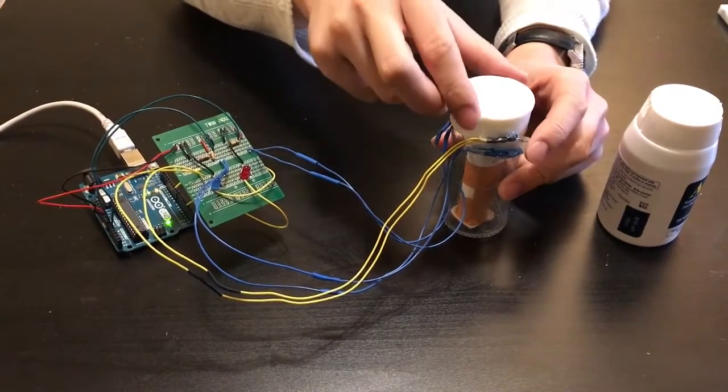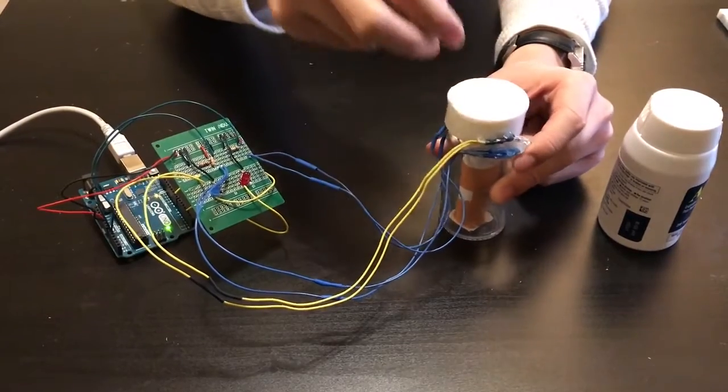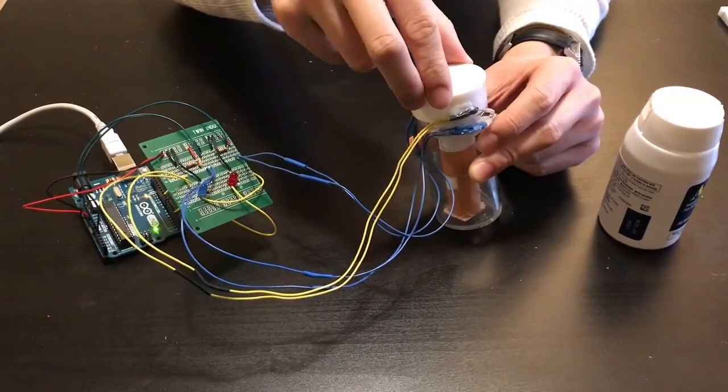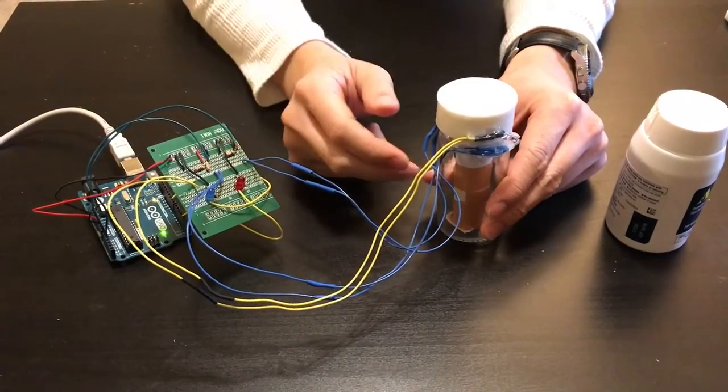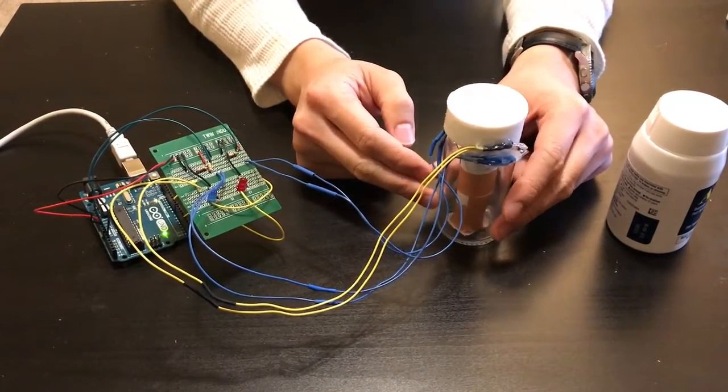To keep track if the patient has taken the pill we have an IR sensor to detect if the pill bottle has been opened and also a pressure sensitive resistor to count how many pills there are.